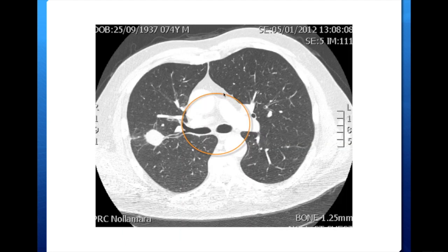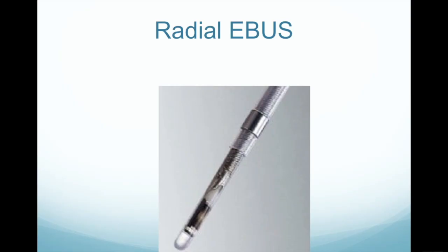In this case, I know that my bronchoscope is only going to reach so far, so I'm not going to see this nodule. I will see the right main bronchus, the upper lobe, and these segments, but I won't see beyond those because the bronchoscope will not be able to fit into the small airway. So radial EBUS is going to be very important to make sure I'm in the right airway and that I don't head off into a wrong airway and biopsy the wrong part of the lung. This is the radial EBUS — an ultrasound probe; EBUS stands for endobronchial ultrasound. It spins around in a radial fashion, sitting within a guide sheath, which is a plastic sheath with a metal tip. The metal tip allows us to see where it is on the fluoroscopic images during the procedure.